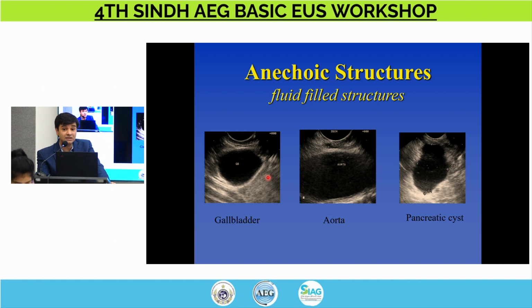That typically tells you that there is something within this lesion that is increasing the transmission of ultrasound waves, and this is called acoustic enhancement. So looking at what is below a black structure will tell you what the structure is made of. It's not the blackness of the structure itself.